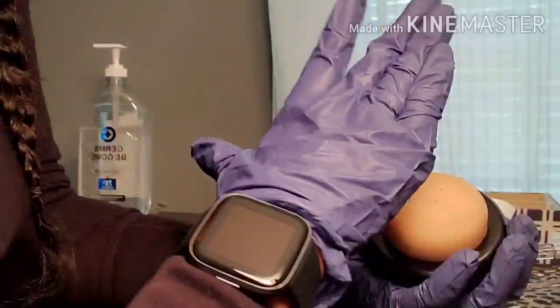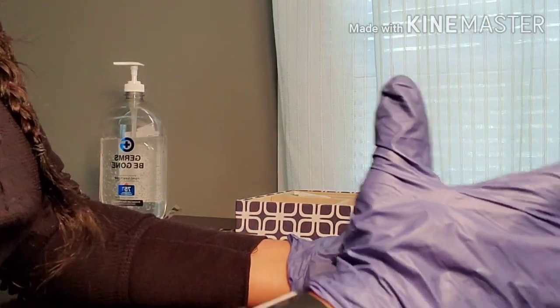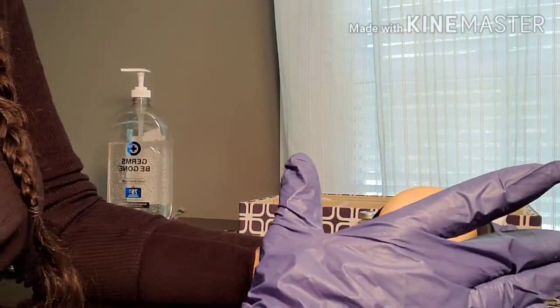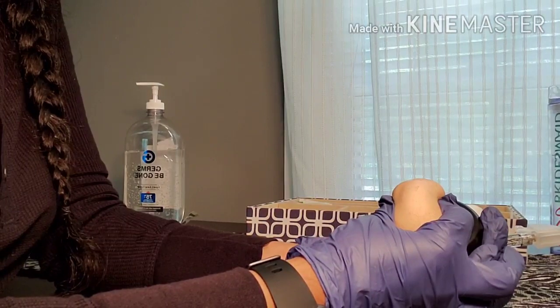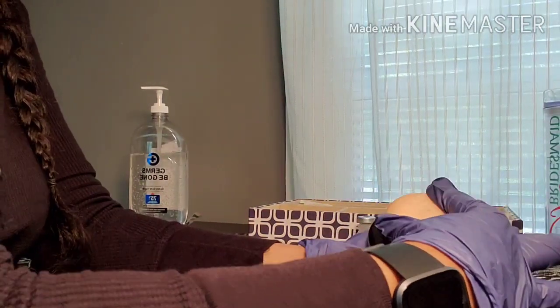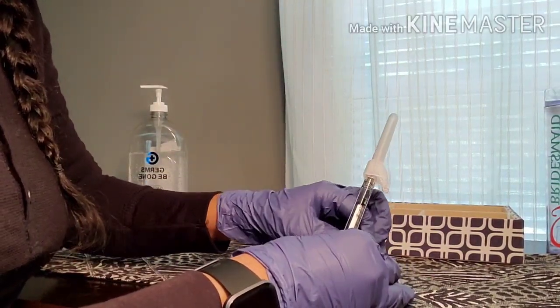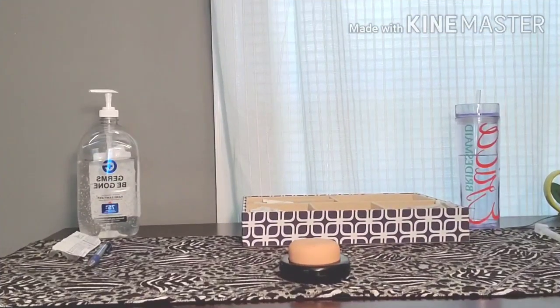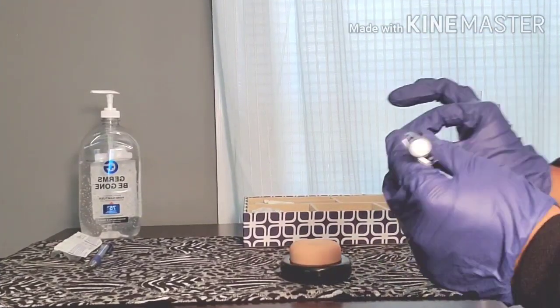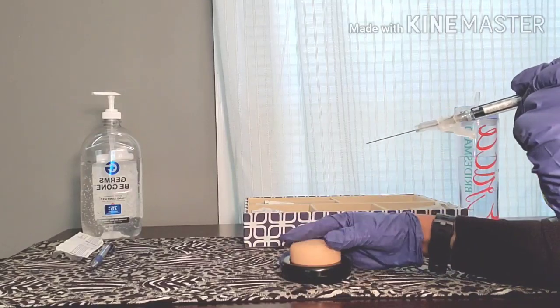There are a couple of ways to position your hands for an IM injection: the Z-track method using the last three fingers to displace skin one inch, pinching for a smaller muscle to ensure you reach it, or most commonly holding the skin taut on top. I'll clean the deltoid in a circular motion starting at the insertion point and moving outward — once I go out I don't go back in. I clean the site and allow it to air dry.